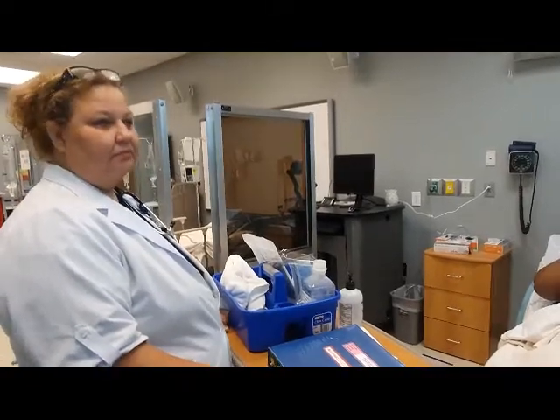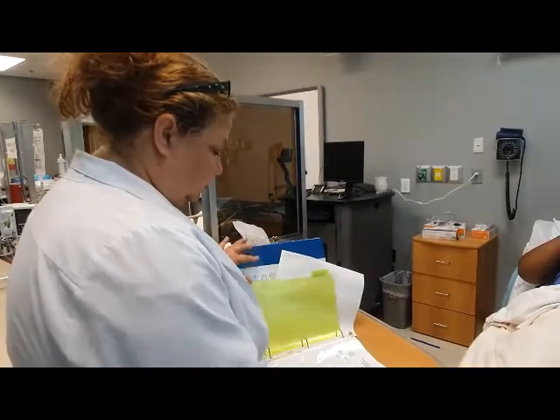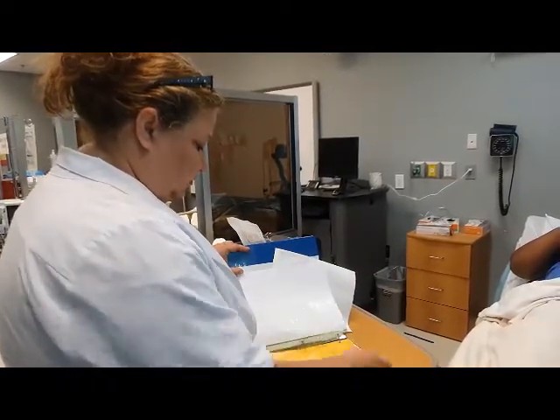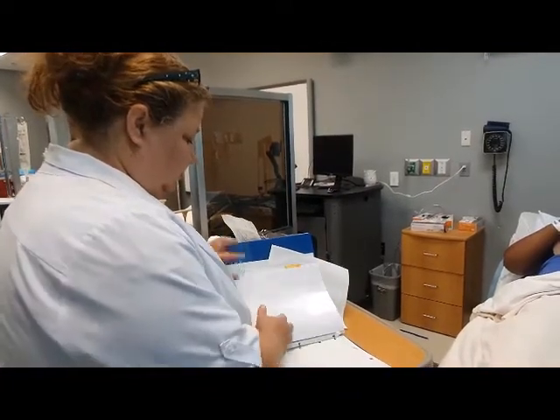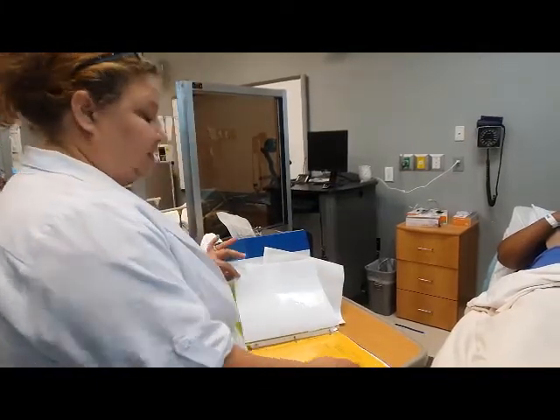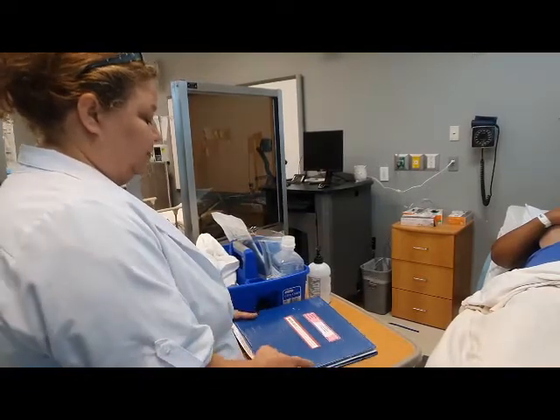Facility protocols for tracheal suctioning. Review the patient's chart for general consent, specific orders for frequency, depth of suctioning and oxygen administration, and allergies. Obtain appropriate assistance for the procedure if it's needed.